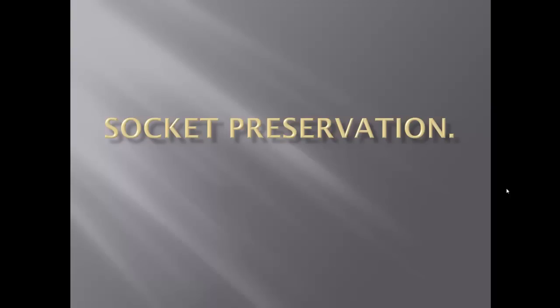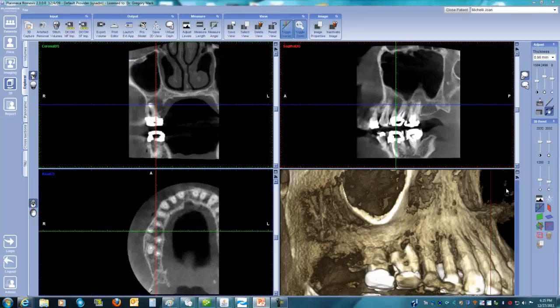Today I would like to present a case called socket preservation that I just did in my office. I'd like to share with you the procedure that was done. The patient presented in my office with a periapical abscess on tooth number 3.